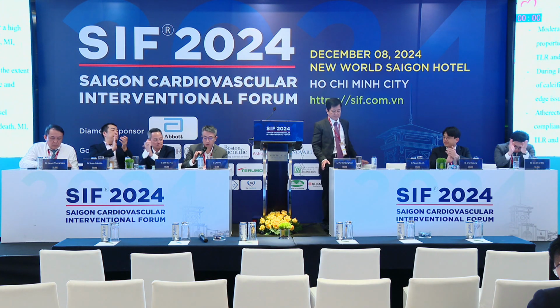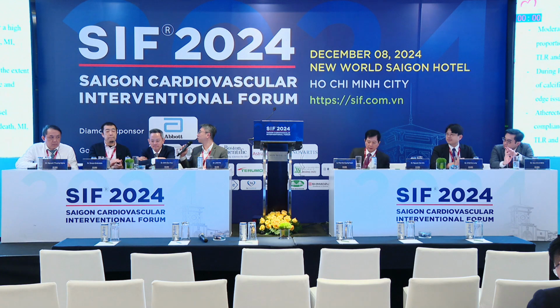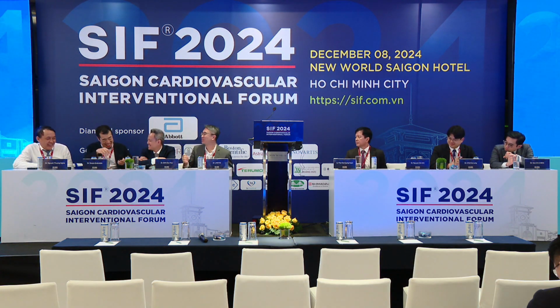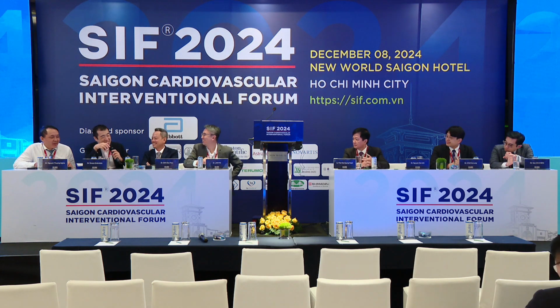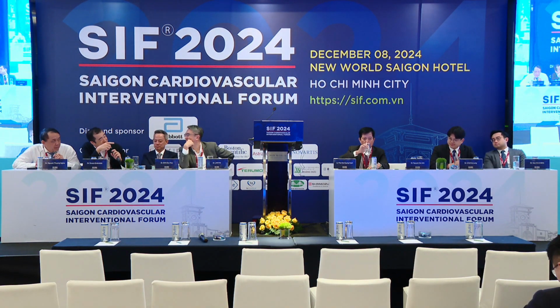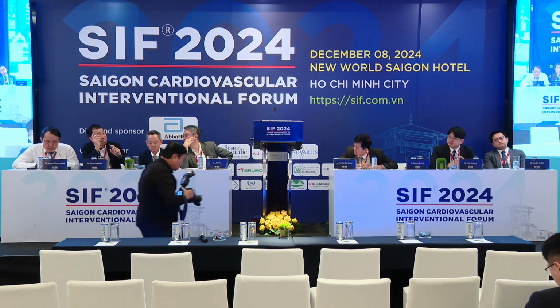Thank you, Professor Hun. Any comments about the session? Yes, I already talked about calcium. As you mentioned, IVUS and OCT measurement is very important, and we can also speculate whether the lesion will expand so that we can deploy the stent. Raj already talked about DCB being better in such situations.